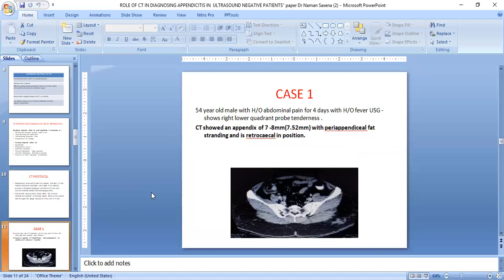Case 1: A 54-year-old male presenting with history of abdominal pain for the last four days with history of fever. Ultrasound showed right lower quadrant pain and tenderness. CT showed appendix diameter of 7 to 8 mm with periappendiceal fat stranding, and we were able to see the retrocecal position of the appendix, which is usually missed on ultrasound.